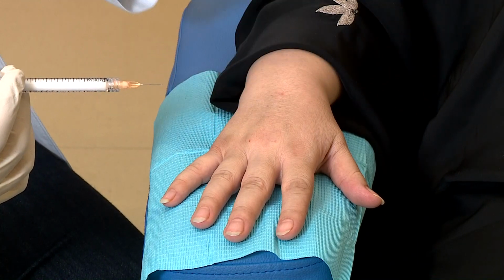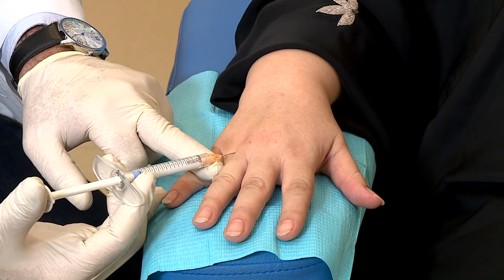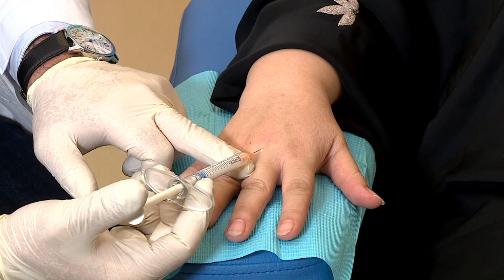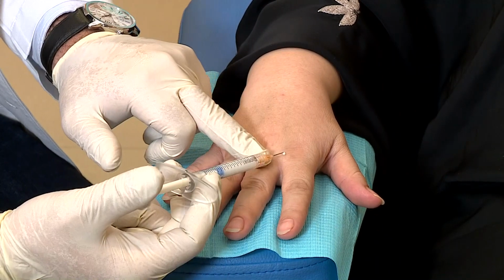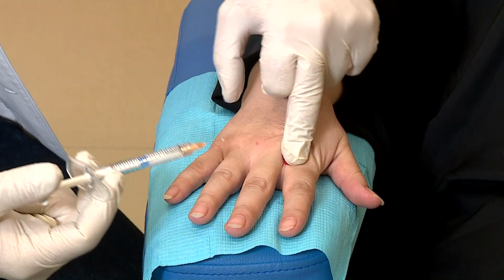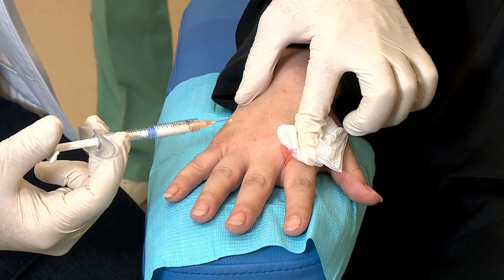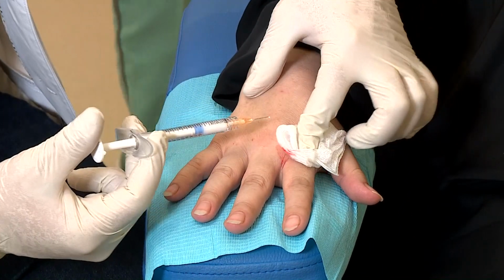Using the sharp needle, you go directly to the areas that you want to inject. Maybe you can start distally, from the distal part of the hand, going proximally, like here, and then you inject a little bit, also subcutaneously. Also you go to this part. Distributing small boluses in each part. As you can see, the only difference is the risk of bruises and swelling with the needle compared to the blunt cannula.